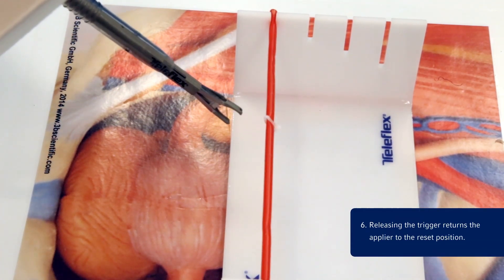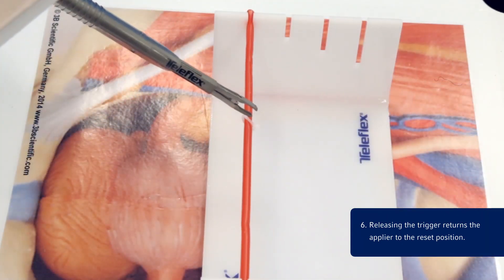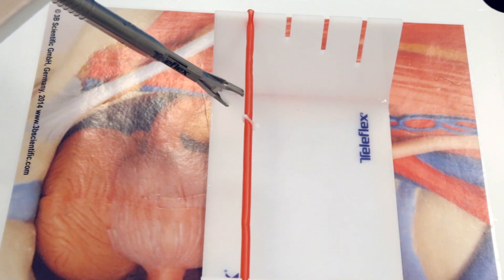Step 6: Releasing the trigger returns the applier to the reset position. Once the applier is in the reset position, squeezing the trigger will automatically load the next clip into the applier jaws. Each time a clip is reloaded, ensure it is reloaded intracorporeally and off the structure.